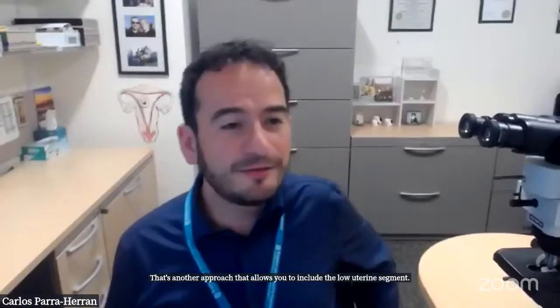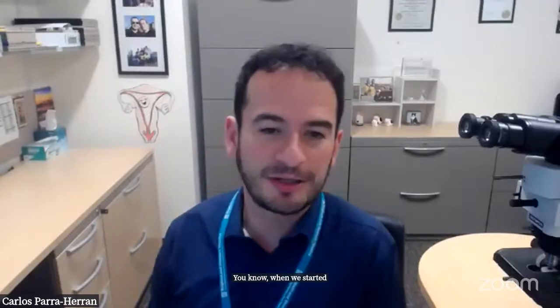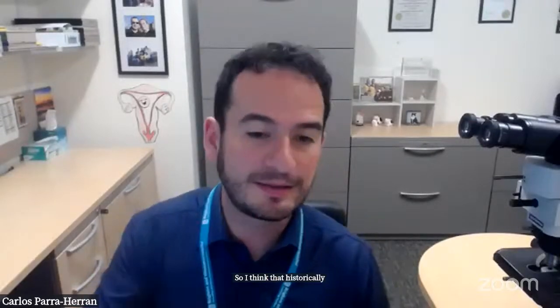I think a lot of this is determined by the practice. When we started talking about patients with Lynch syndrome, we had the Bethesda criteria that said these tumors, when you have a patient with Lynch syndrome and endometrial cancer, usually arise in the lower uterine segment. So historically, practices that see a lot of those patients, like mine, probably decided to start sampling the lower uterine segment in those populations, and it just permeated into all other instances.